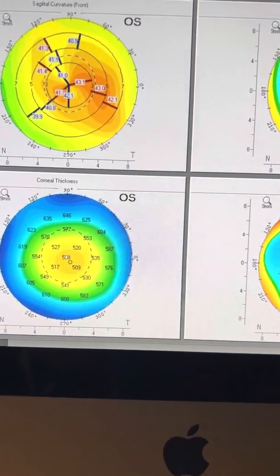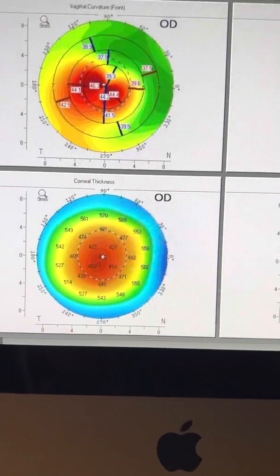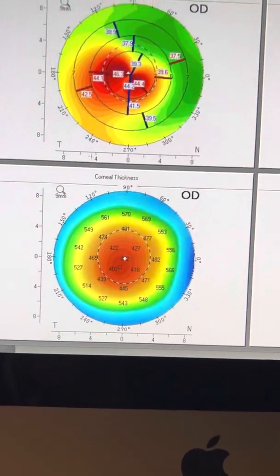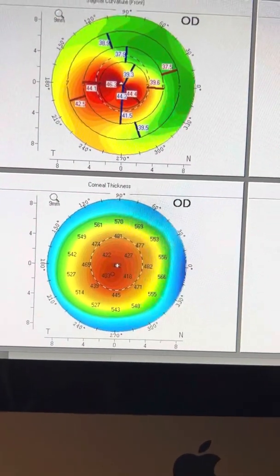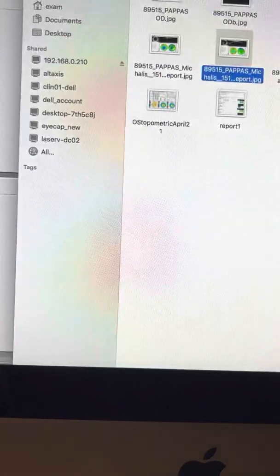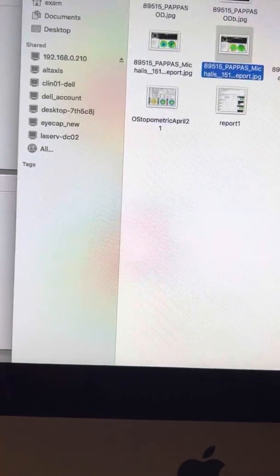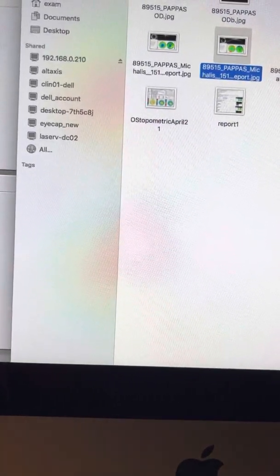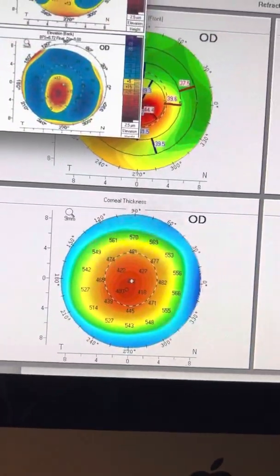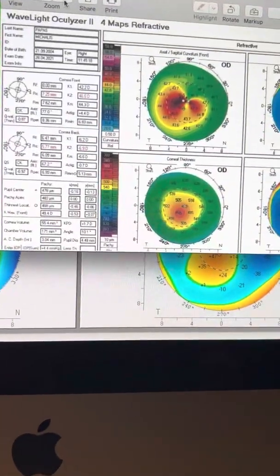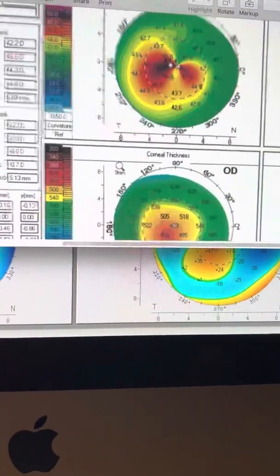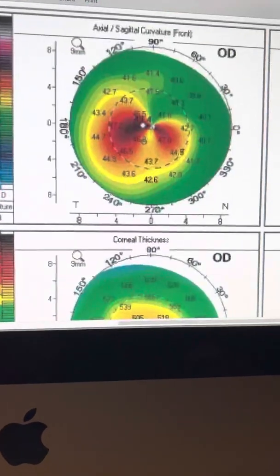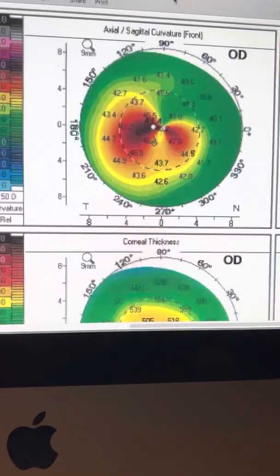So in retrospect, what we can say is that, of course, we applaud the fact that this gentleman, for the picture that he had back in April of 2021, that he did receive a cross-linking treatment. We completely agree with that. This was advanced keratoconus on the right eye.